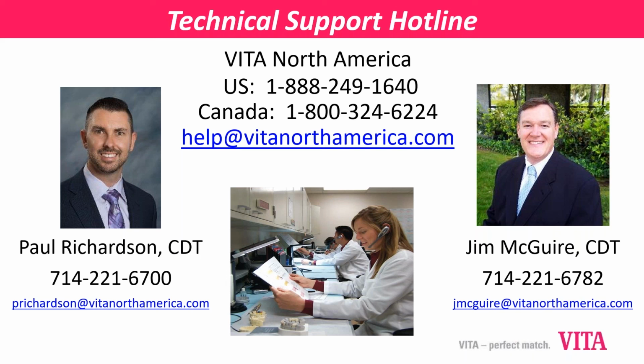With each batch of these rings, you get a piece of paper. It tells you, starts at 20, it'll say 19.9, 19.8, all the way down to whatever. So when you fire your zirconia, let's say you're firing the ST at 1530, it comes out, you put a ring in there while you're cooking your zirconia, not by itself.